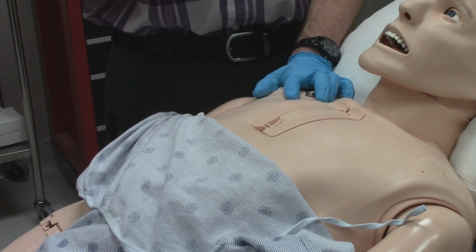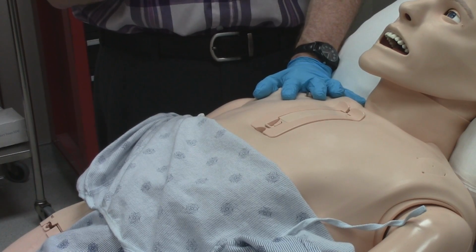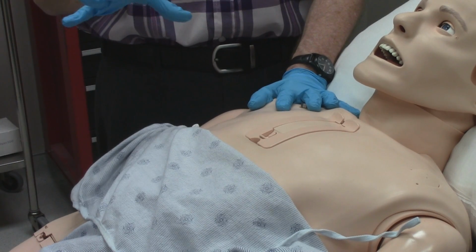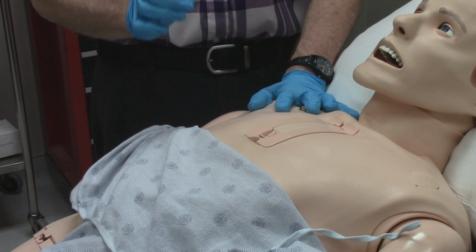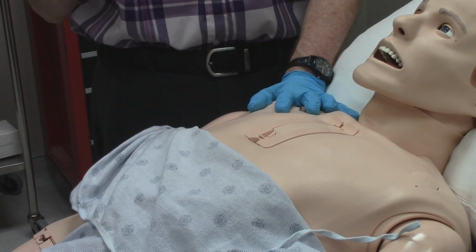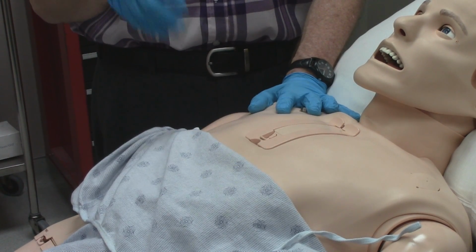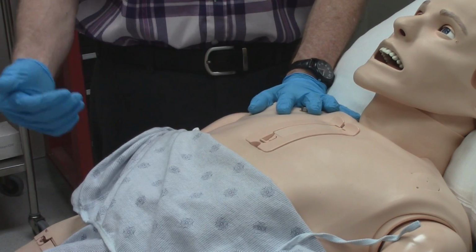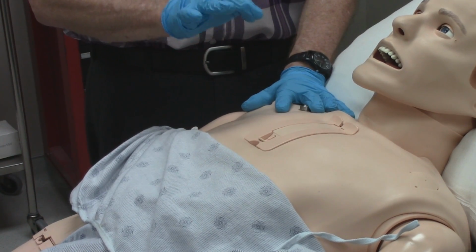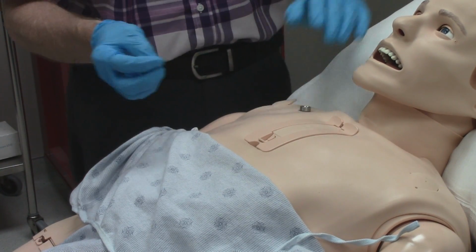Now, even though with a real patient you would probably use a 14 gauge 2-inch needle to perform a pleural decompression, when we stick the simulators in the simulation center, we always use 20 gauge needles or smaller. We never use large bore needles on our mannequins because they tear up the plastic more quickly. They make big holes. 20 gauge or smaller needles will make little holes that will close up very quickly and allow the mannequin to last longer.